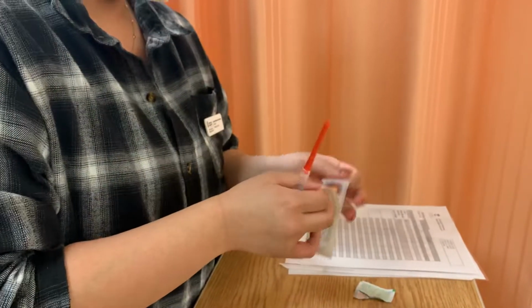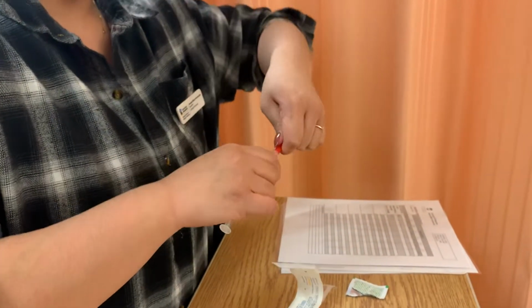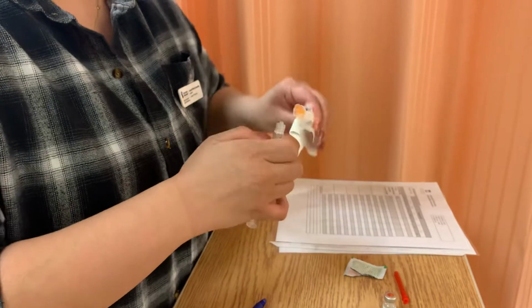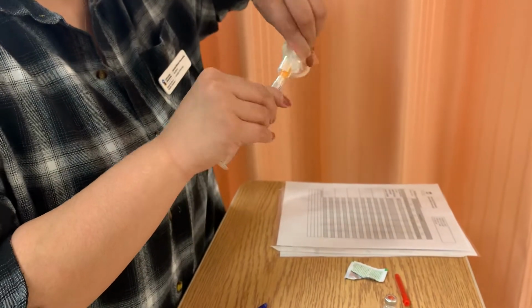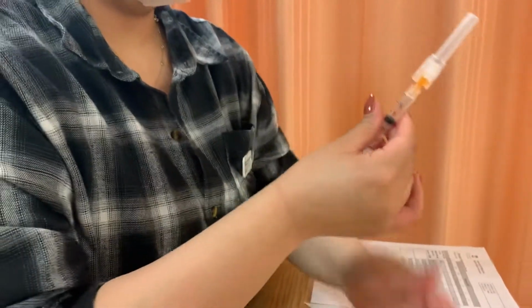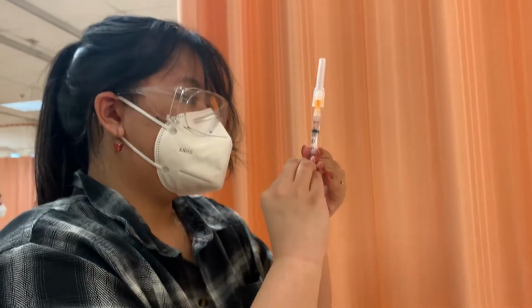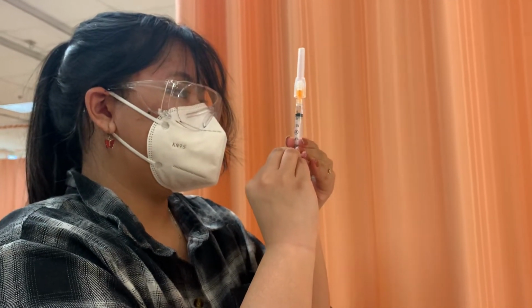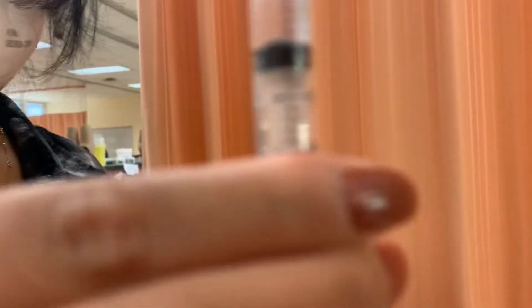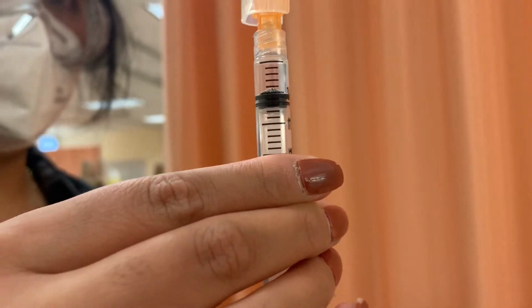I have that ready. Open. I'm just going to get rid of this. Twist it on. Okay. Now I'm going to push it back up. Make sure there's no air bubbles. Half an ml. There you go. There's no air bubbles. Half an ml.